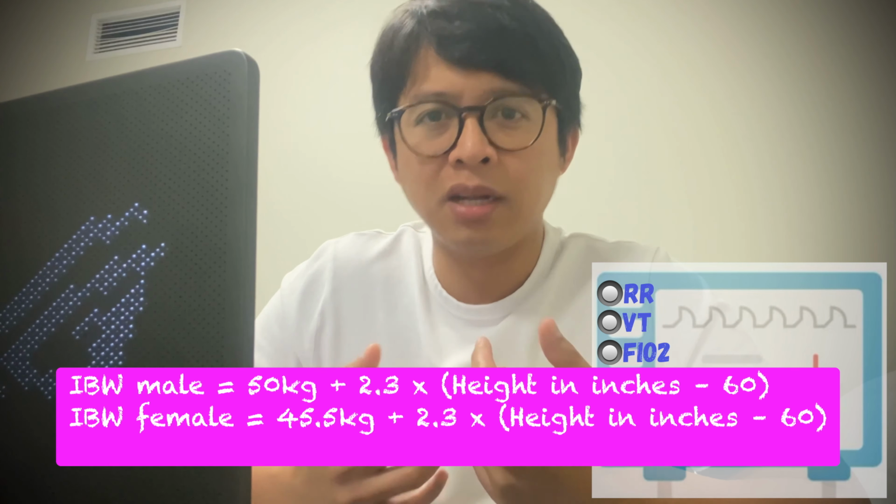Got it? Now, the question is, how does the ventilator know when to give a breath? The mechanism of a ventilator responsible for that is the trigger. The triggering mechanism determines how a mechanical breath is initiated. The variable also determines whether a mode of ventilation can be described as mandatory or spontaneous. Mandatory means that the machine controls the breathing, and on spontaneous, the patient breathes on their own or in synchronization with the machine.